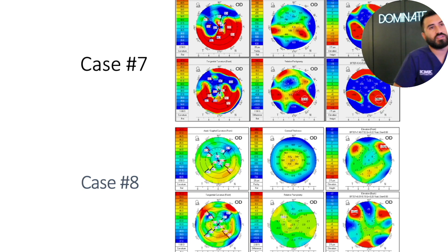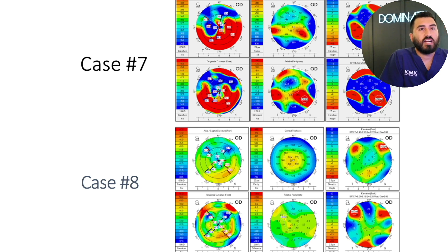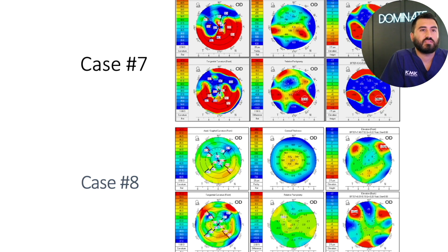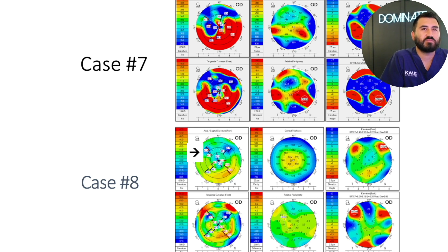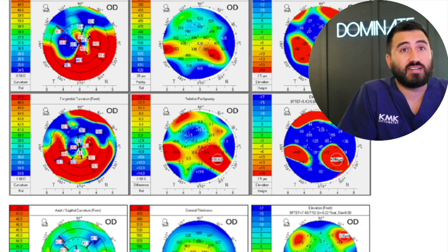Let's go over a few other cases here. In that top picture and in the bottom picture, you'll see that overall this looks like one of those goofy scans — you kind of have flattening centrally-ish. This is RK, 8-cut RK up top. On the bottom, you can actually see the two-cut RK, the two cuts that are making that cornea flatter up top. If you see something and you're like 'I have no idea what this is on boards,' just pick RK.